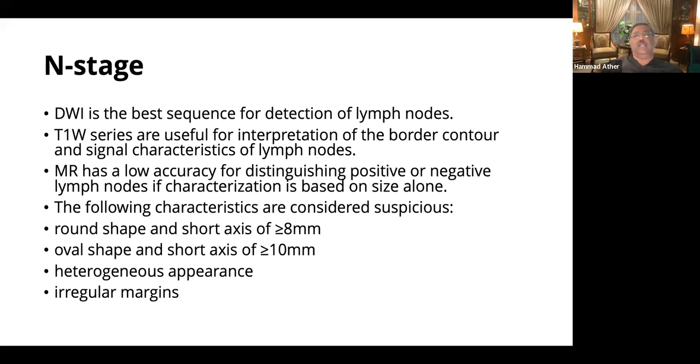And as I've said, when you're doing an acquisition, you need to have a T1 weighted image, preferably with contrast before, during and after administration, to see from the bifurcation of the aorta down to the ureter, to identify all the lymph nodes in the external iliac, internal iliac, obturator, common iliac, and up to the bifurcation of the aorta, and then obviously the lymph nodes in the mesorectum. And all these are important.